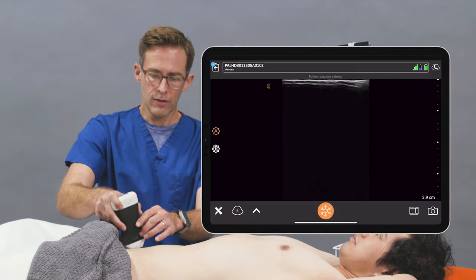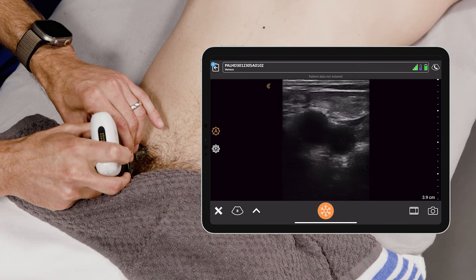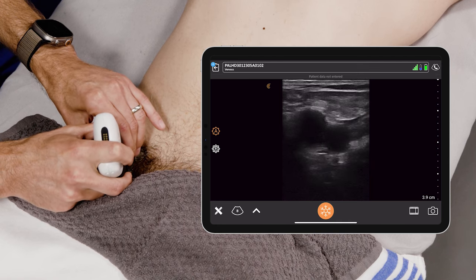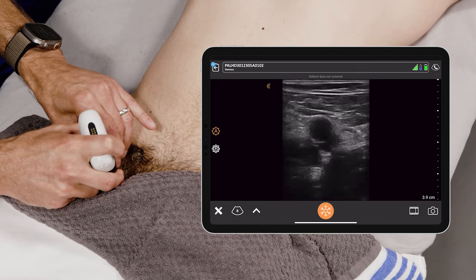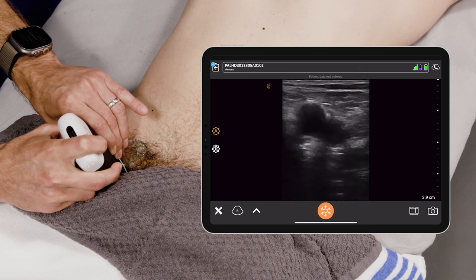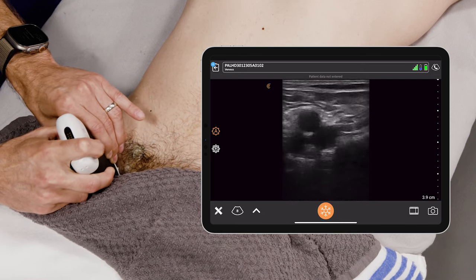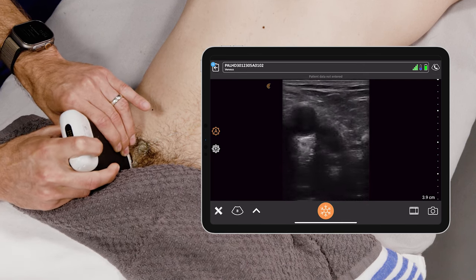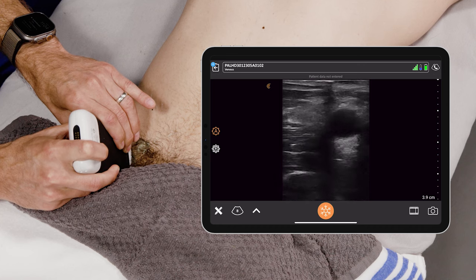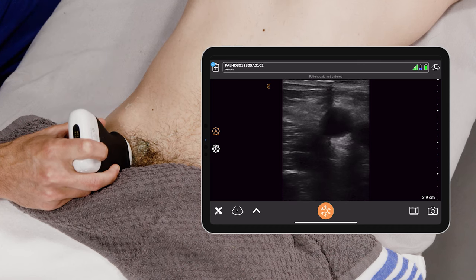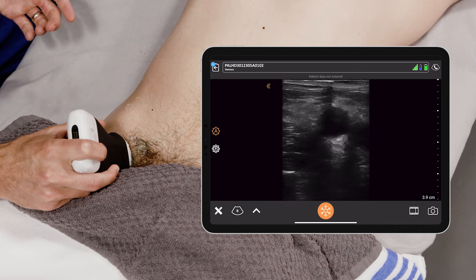We take the probe and go along the femoral crease. What we initially identify are three major structures of this inguinal crease area: the nerve, the artery, and the vein.